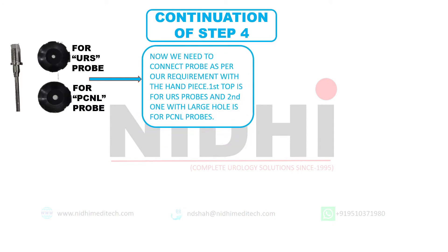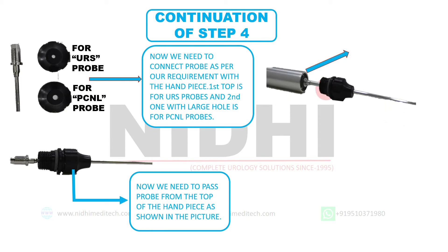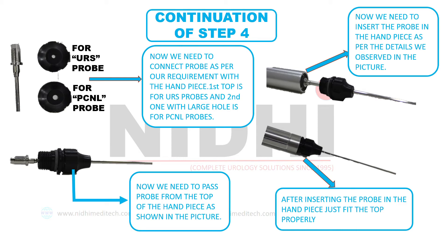Now we have a total of 3 handpiece tops in the handpiece box. Out of these, two will be used with URS probes and the other one with the large hole will be used with the PCNL probe. Take the top and just pass the probe through the top of the handpiece, as we can see in this image. Now insert the probe into the handpiece. Remember, the portion on which the Neeti logo is embossed will go first into the handpiece. This image shows the perfect connection of the probe with the handpiece.